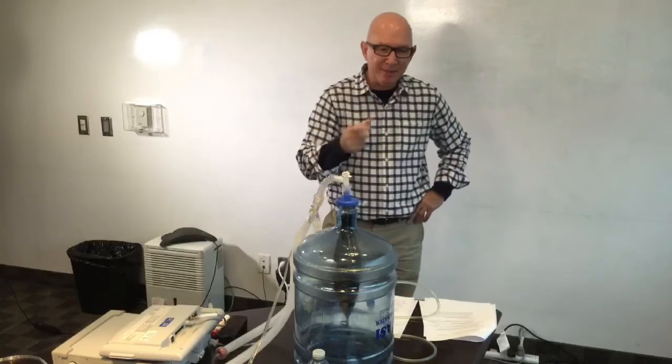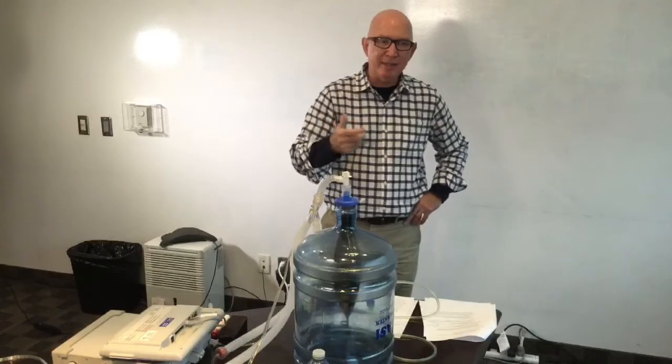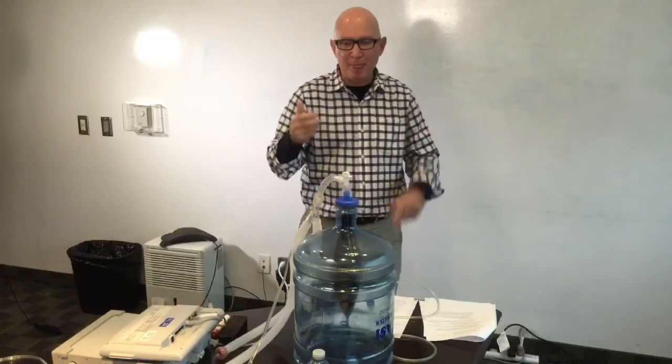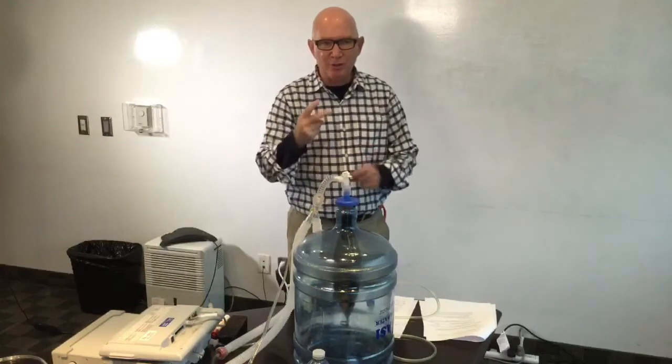And one of the main things that happened with dyssynchrony in SIMV is what's called double cycling or breath stacking, the way we typically have thought of it. Although when someone says breath stacking to me, there's 2 things that can mean.